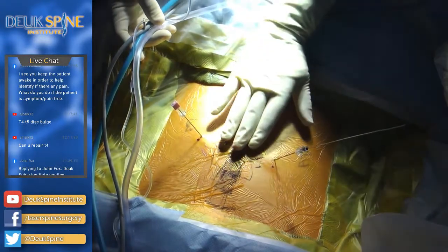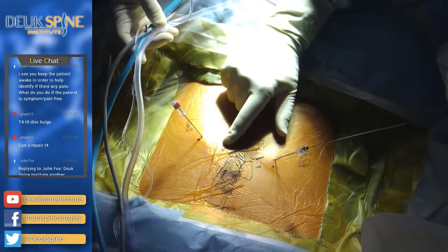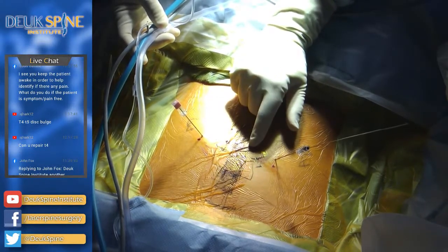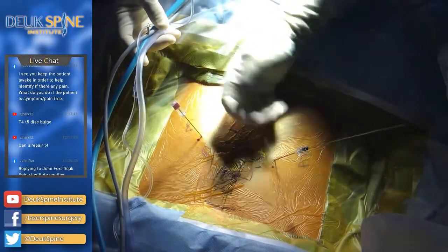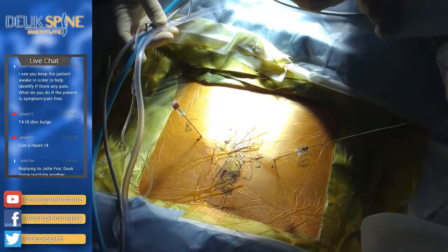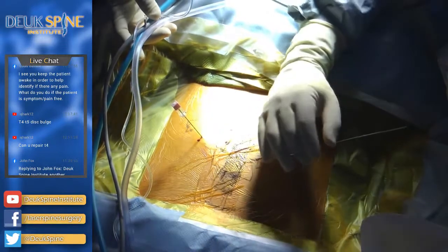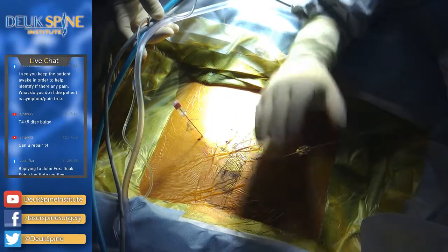We're not doing this surgery for pain. He does have pain, and it's coming from the herniated disc at T11-12. But that's not why he's having the surgery done. He's having the surgery done because the spinal cord is getting crushed. In the front of the spinal cord, a herniation that goes from side to side is pushing up against the spinal cord. We're gonna go in there and remove the herniation on both sides, so nothing is pushing on the spinal cord anymore. So we're not doing a pain surgery today, folks, even though we are gonna fix his pain. We're doing a decompression surgery, shot.